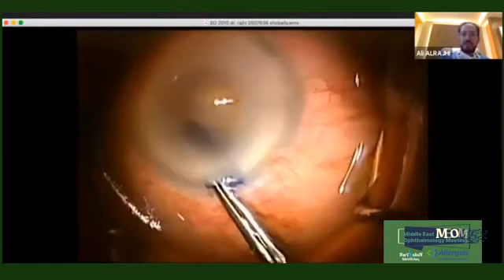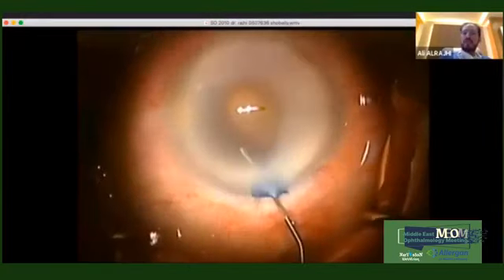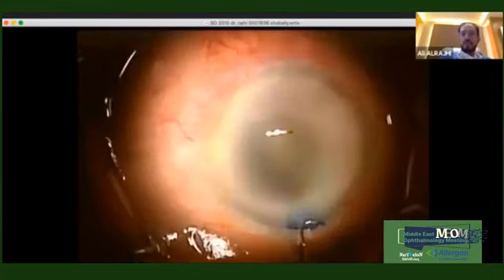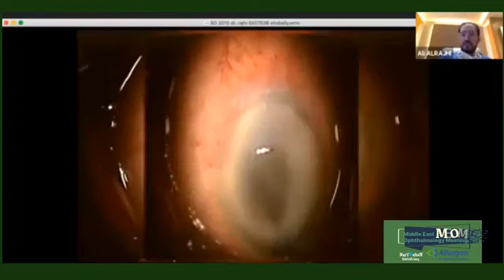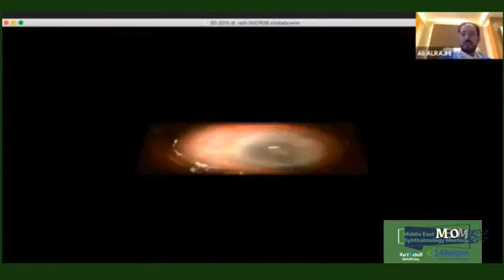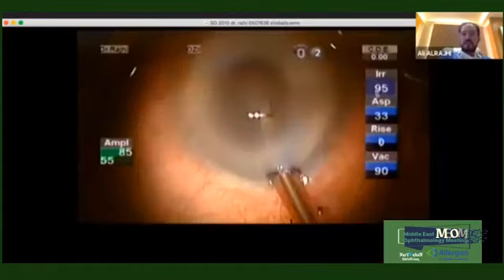You notice that the pupil is not so dilated, and the periphery of the cornea is denser than the central part. In these cases, it's always important to manipulate the lens and nucleus, rocking it around, and sometimes doing more or less anterior phaco.